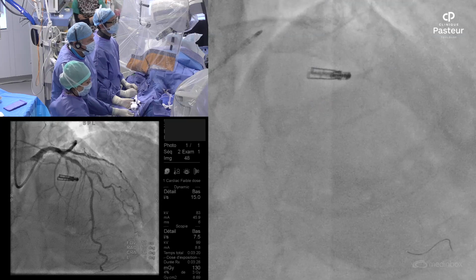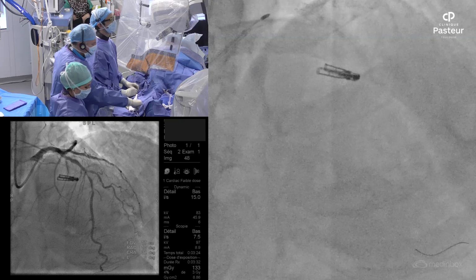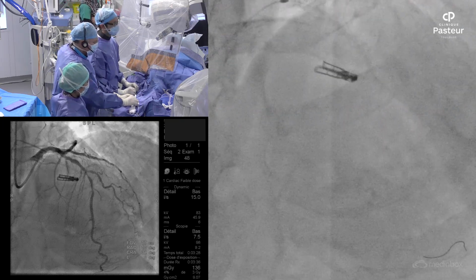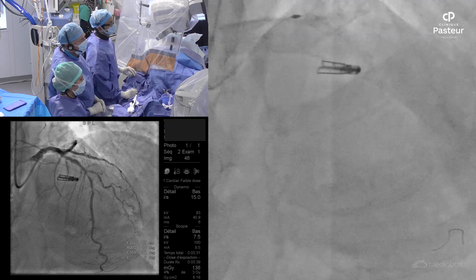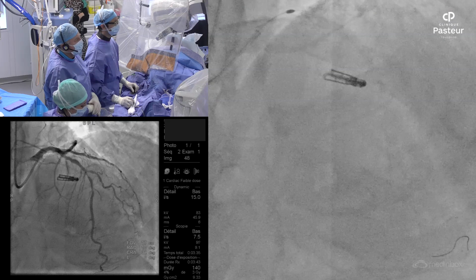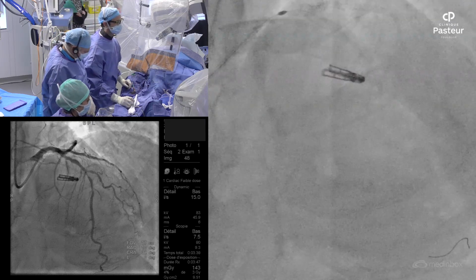And for the purpose of the discussion on the surgery, this patient underwent an acute coronary syndrome. And we know the limitation of surgery in this kind of case. If we discuss surgery for this patient, remember that he underwent a STEMI last week. So percutaneous is a good approach.